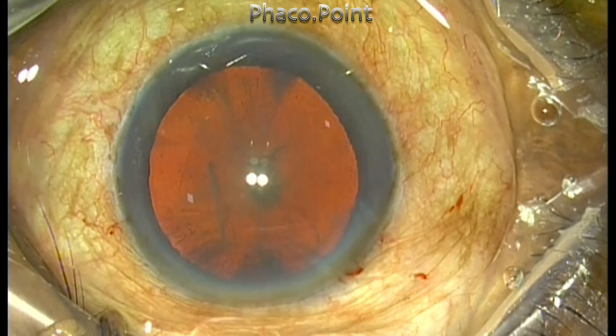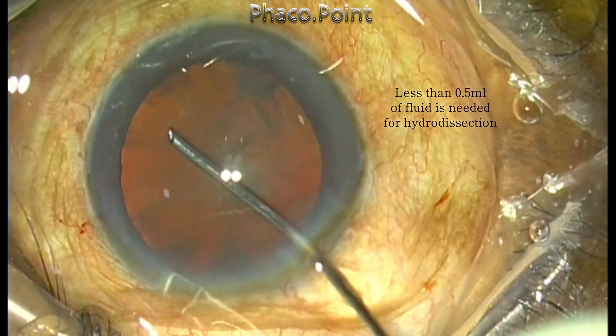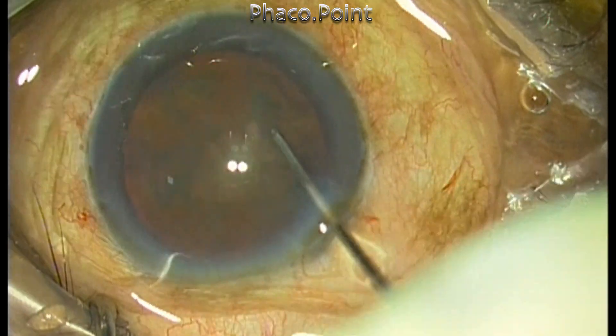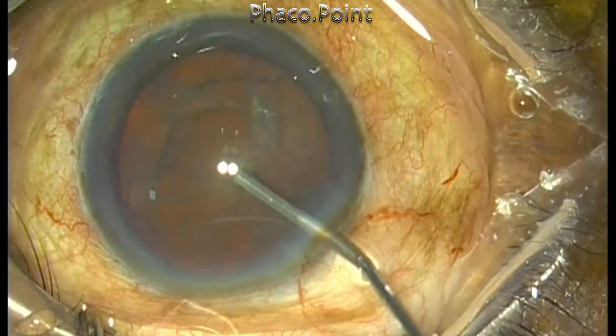The cortical cleavage hydrodissection is done by injecting very small amounts of fluid in multiple locations, and this is usually enough. It's much easier to achieve nucleus rotation and completion of cortical cleavage hydrodissection in harder cataracts than it is in a grade 1 or grade 2 nuclear sclerotic cataract.